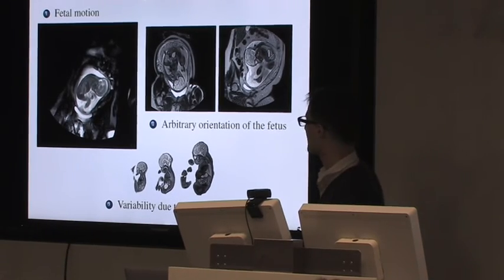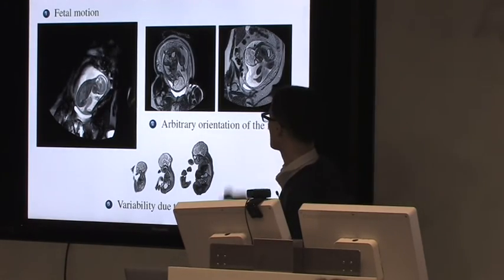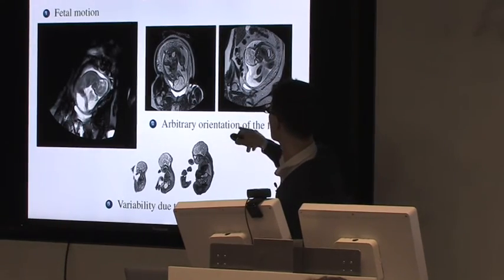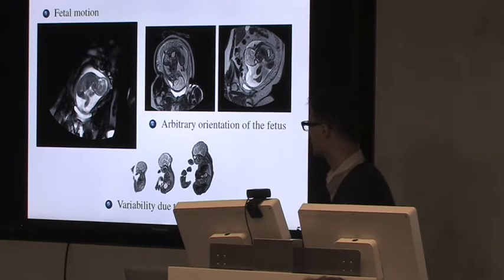The problem is, well, the fetus, it's an object in 3D, and it can be in any orientation. I mean, that's the bladder of the mother, so you know that the head is there and the legs are here, but the baby can be upside down, whatever.